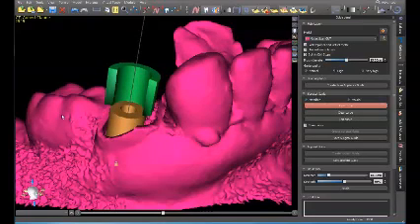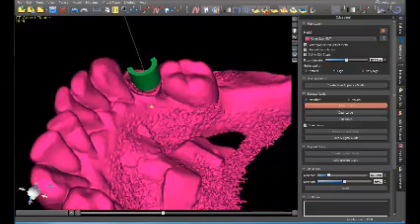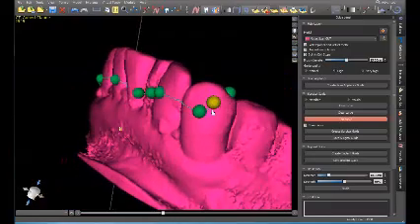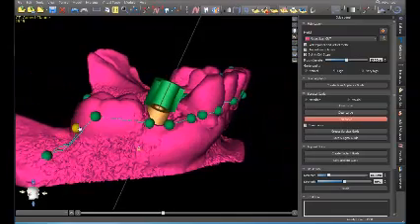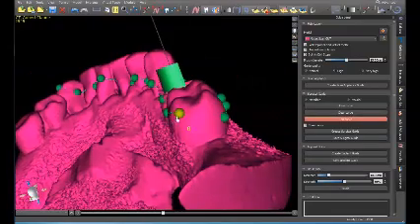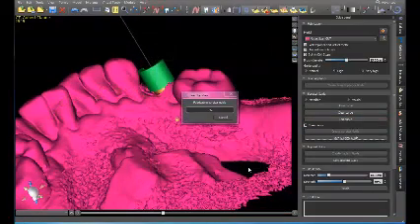So draw curve, shift, edit curve, and then press create surgical guide once again. So really the scenario surgically is we'll take the tooth out, then place the guide, then start drilling our pilot drill hole.